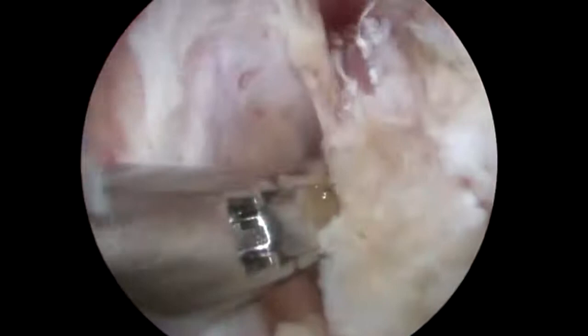On the left is the subscapularis muscle, one of the rotator cuff muscles. On the right is the capsule. I'm just going to bite through that. I then shave it so there's a space between, so it doesn't grow back easily and cause more scar.